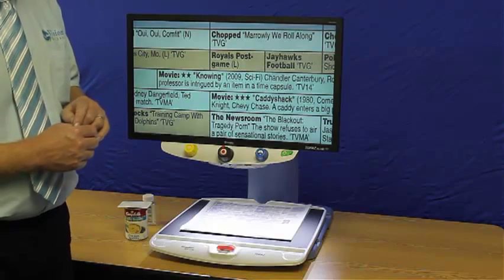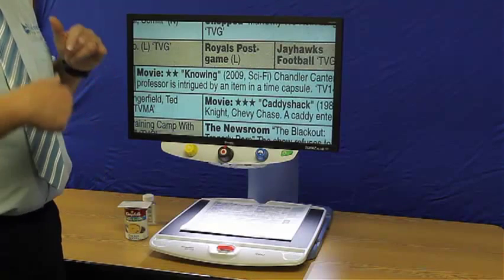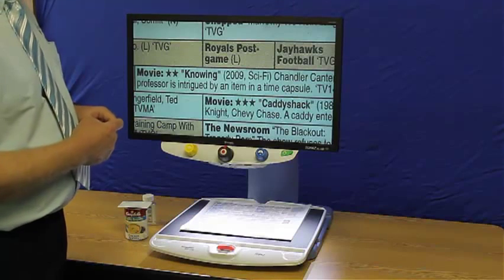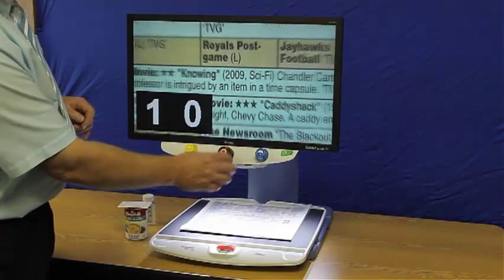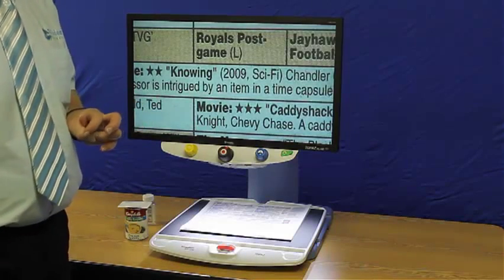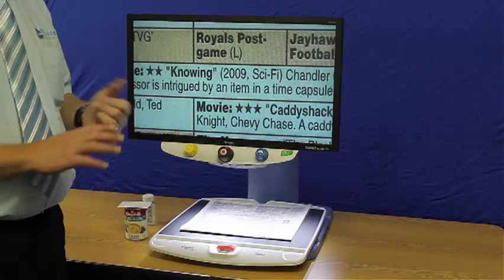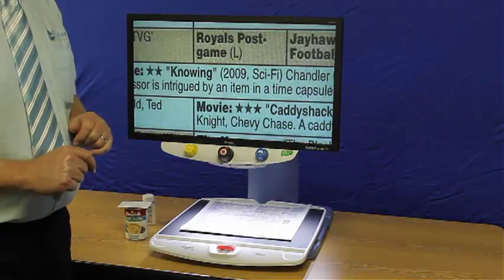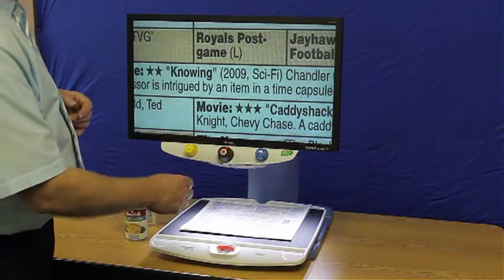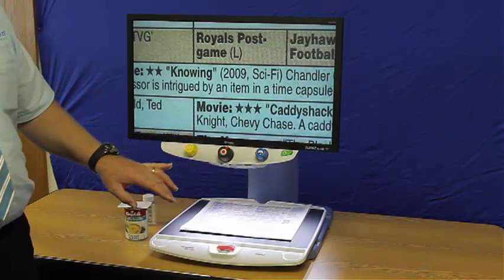There are 16 levels of magnification, depending upon how big what you're looking at is, and also the size that you need to have it to look at. In the bottom left-hand corner, a number appears for just a short period of time that tells us what level of magnification we are at. We can also have it so it doesn't show up, or we could even have it tell you how many times magnified it is.